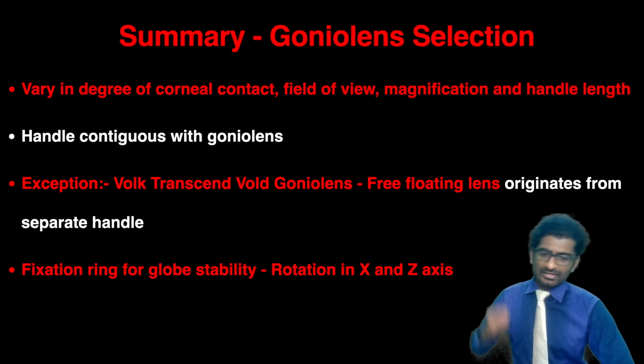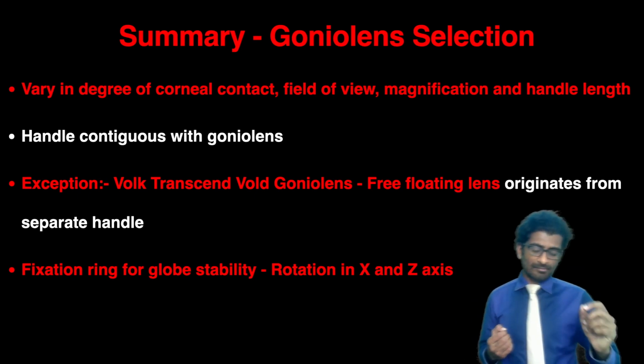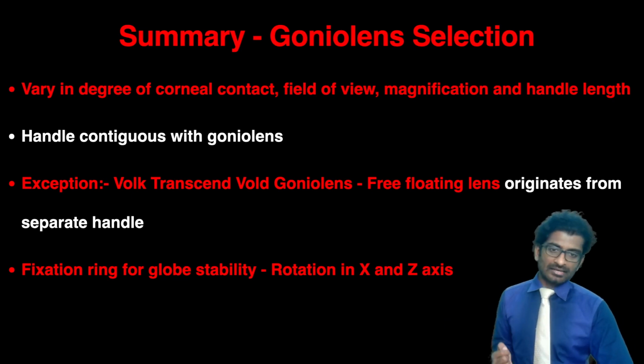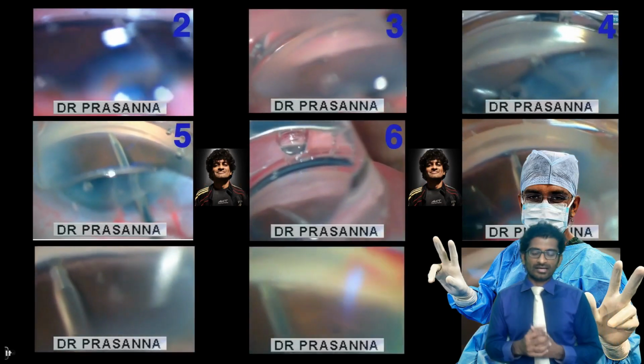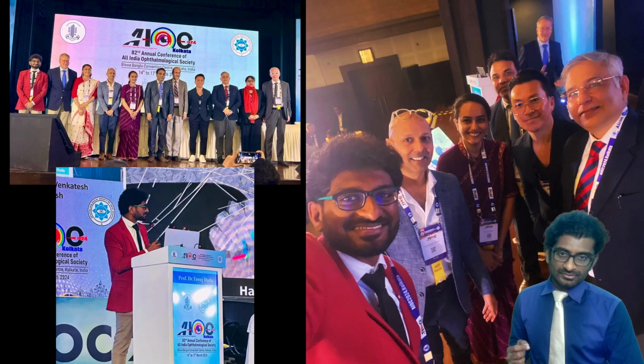So make sure you cultivate your left hand and left leg. You may think it's your right hand and the right leg that is the most pivotal point, but no, the left is as important as the right. So that, my dear friends, is more important for direct gonioscopy. I think if I can do it, I feel my friends out there, neophytes who are aspiring to be MIGS surgeons, you too can.